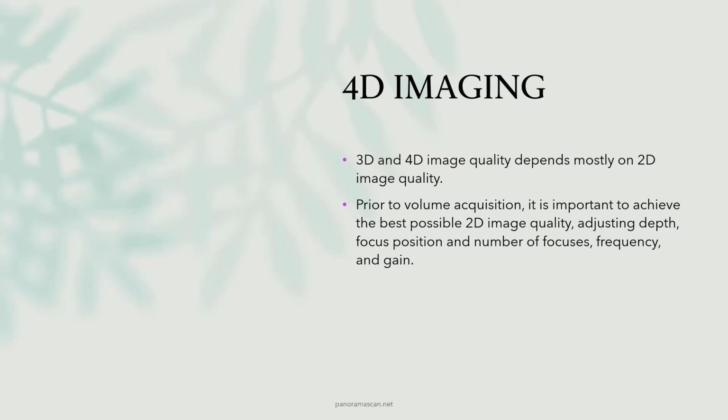Adjusting the gain is another vital step. The gain controls the overall brightness and contrast of the image, enhancing subtle structures that may otherwise be hard to detect. Proper gain settings ensure that the image is neither too dark nor overly bright, maintaining adequate contrast for easy interpretation.